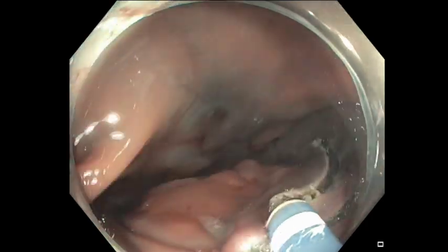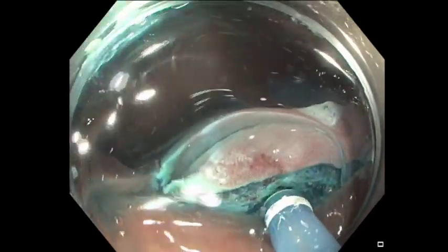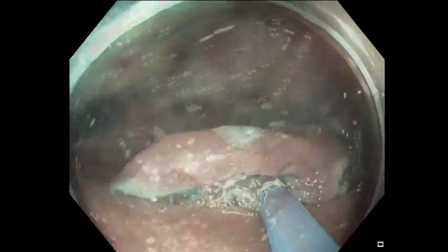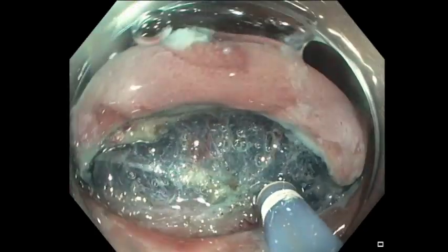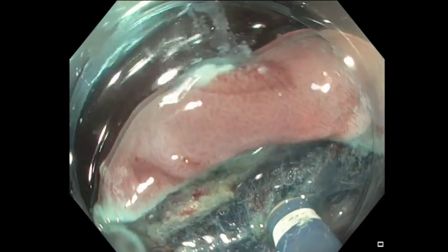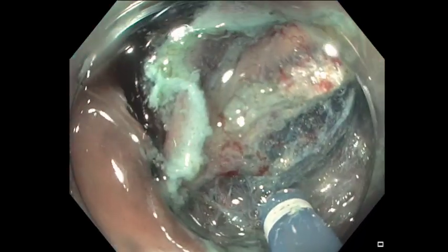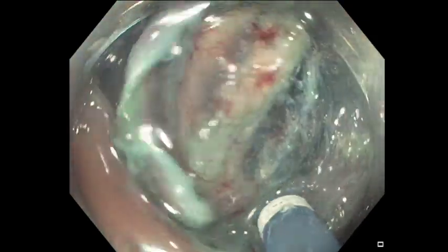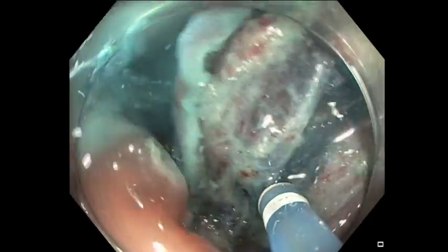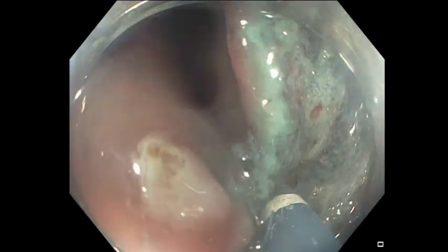So right now we can see that the water and everything is going behind us, which tells me that if I just focus a little bit on dissecting the front of the lesion, it will start to retract. Notice here that initially I worked very close to the mucosa, and I have a good margin of normal tissue, which allowed me to dissect first on the mucosal side. Once I dissected, I exposed the submucosa. Now I'm going deeper in the submucosa. Initially it would be superficial in the submucosa, just under the mucosa, to open your flap. And once the flap is open, the gravity is pulling it to the back.